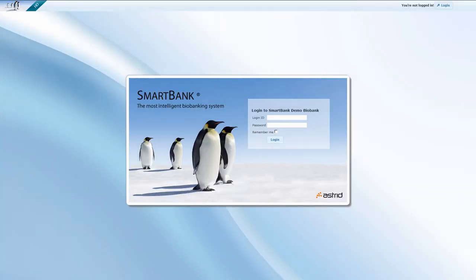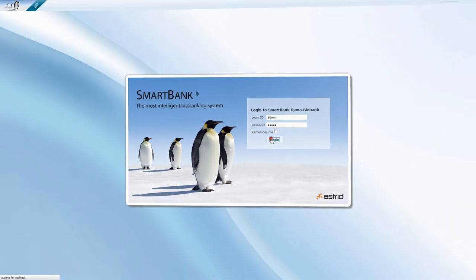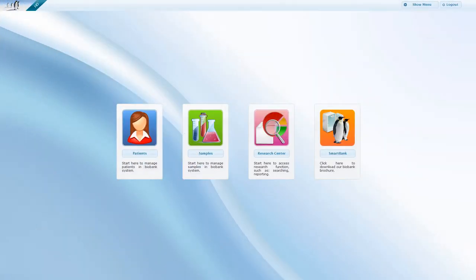Log into SmartBank using your individual login ID and password. Click to log in. The main screen shows you your options.